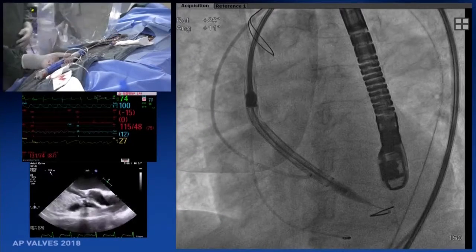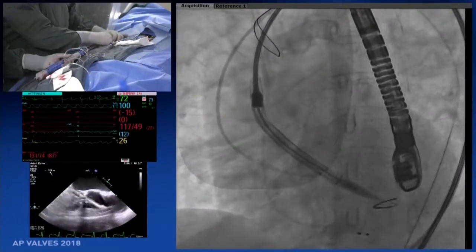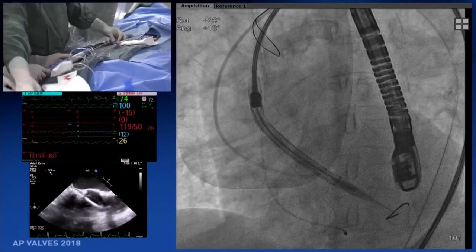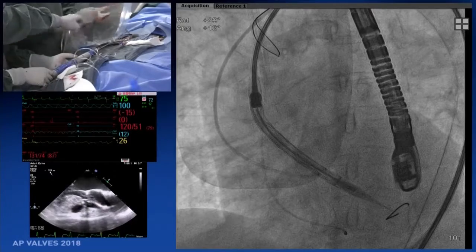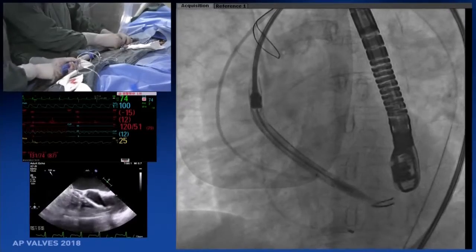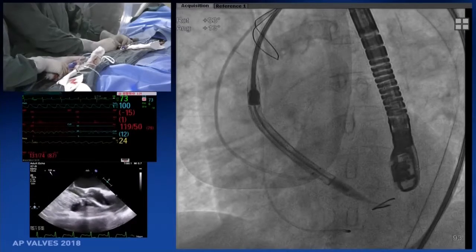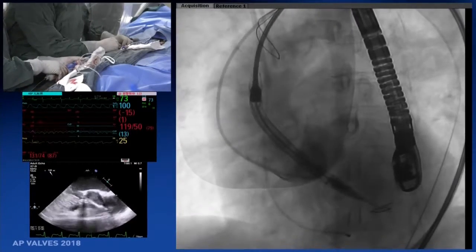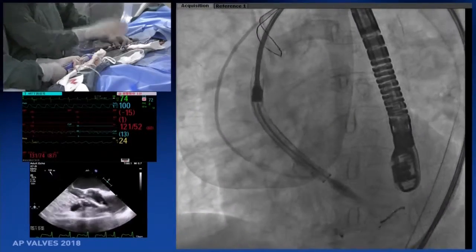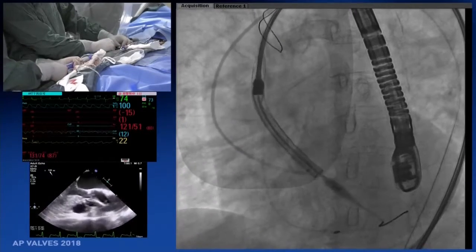You probably this time start a little deeper. Yes, I'm going to withdraw a little bit. I don't want too deep. Not too deep is better, but we cannot go too high, it will jump out. It's difficult. Pull back a bit. That's about right, can't go further. Let me take another image. Should be fine. Go on. I still doubt the two cusps, I haven't seen them completely clearly, because he can't get that view. That's a problem.